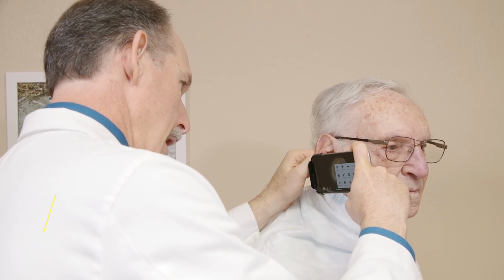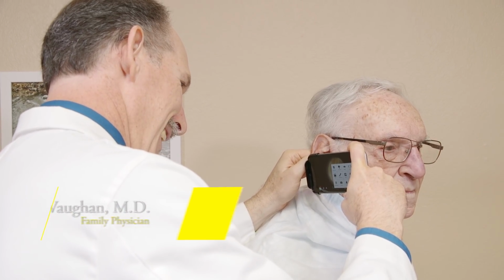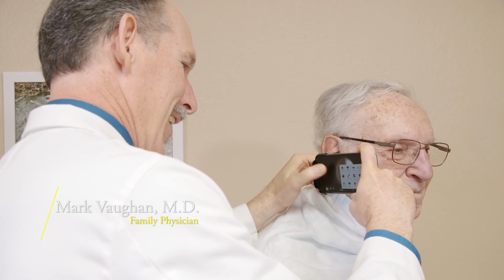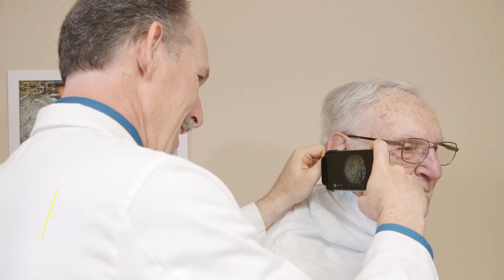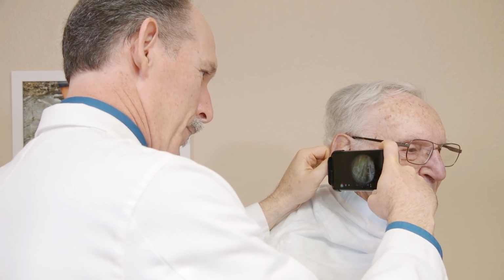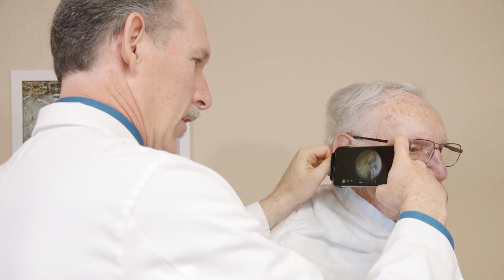Chuck comes because the hearing aid specialist needs to make an impression of his ear, and there's some wax in the way, so we'll get it cleared out. Sherry, how come you can see the light from the other side? Well, I see there's a little round circle over here that came on. Oh, okay. And there is some wax. And I can see how that could create a problem for somebody trying to make an impression for a hearing aid. We're just going to have to get that out of the way.